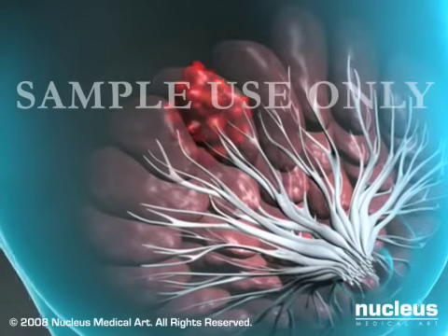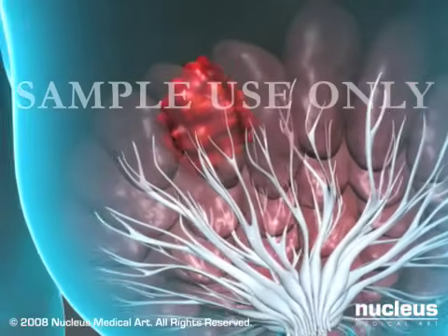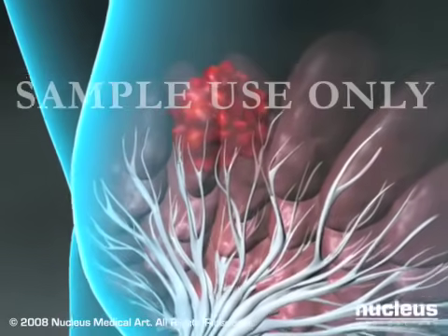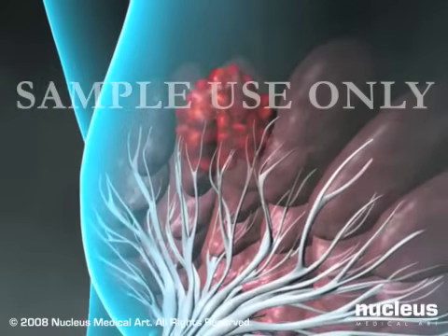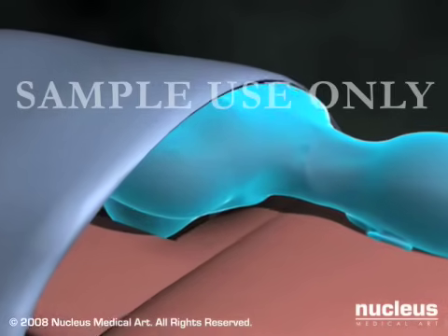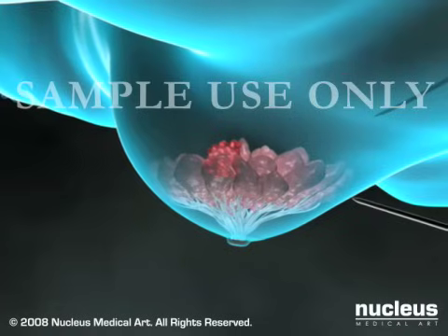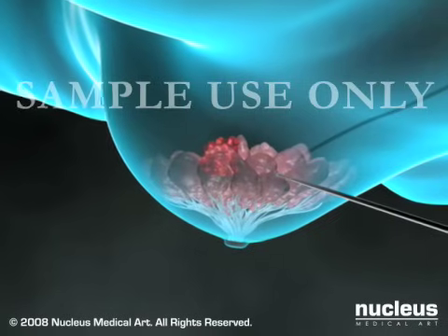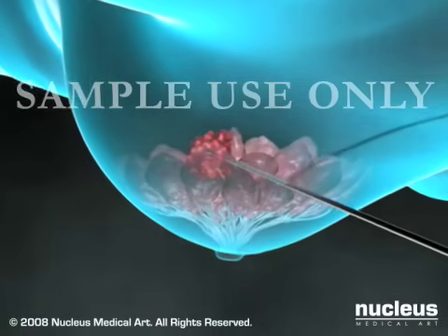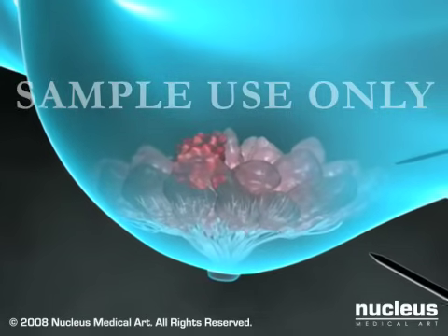If your breast lump cannot be felt and is seen only on a mammogram or ultrasound, your physician may recommend a stereotactic core or ultrasound-guided core biopsy. For a stereotactic core biopsy, you will lie face down on a table with your breast visible through a hole in the table. Guided by a computer-generated mammogram of the suspicious area, your physician will insert a hollow needle into the breast mass and remove several small cylinders of tissue for examination.